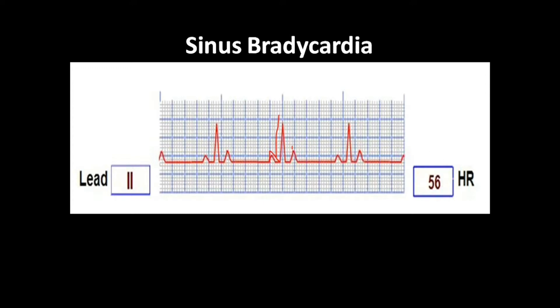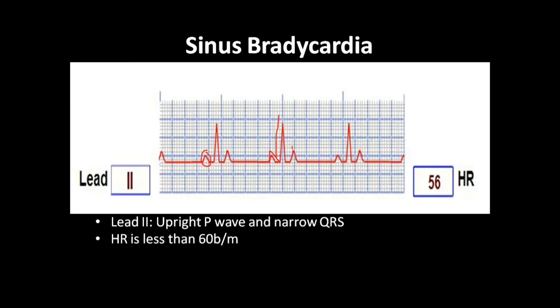If you see the heart rate is lesser than 60 — it is 56 beats per minute. The P wave is always upright in lead 2, and the QRS complex is narrow as usual in a sinus rhythm. The heart rate will be lesser than 60 beats per minute.